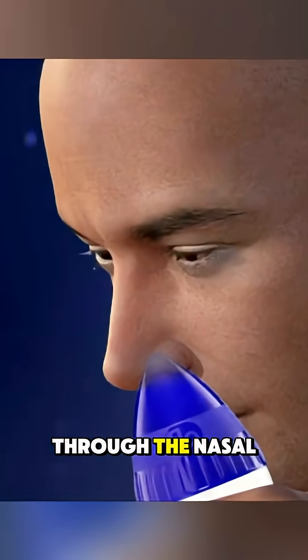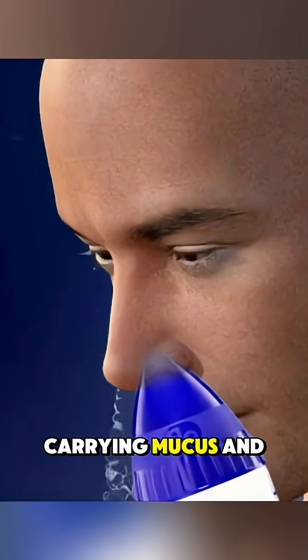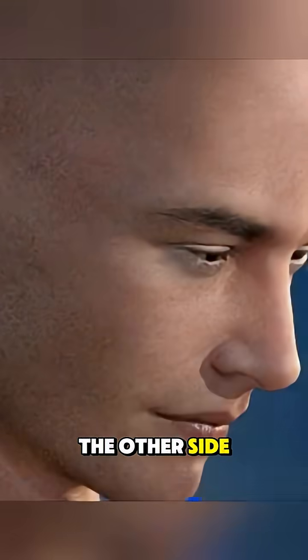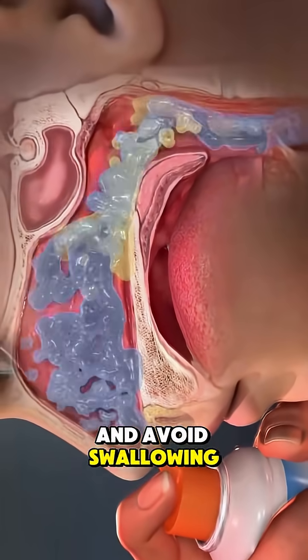The fluid travels through the nasal passages and drains out of the other nostril, carrying mucus and debris with it. You then repeat the process on the other side. It's important to breathe through your mouth and avoid swallowing during the rinse.